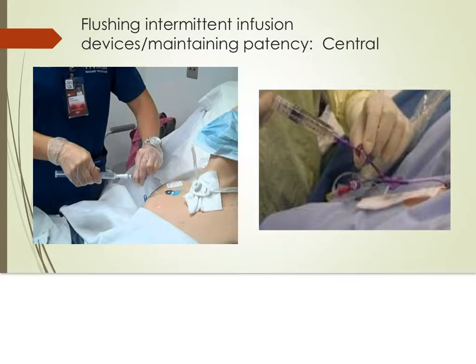To begin, verify the physician's order and the facility policy. Next, wash your hands and prepare your equipment, which includes the flushing solution, gloves, and alcohol wipes.